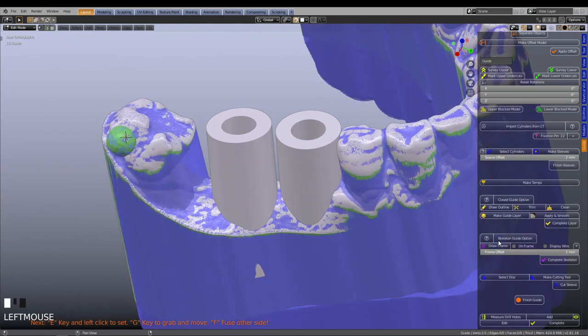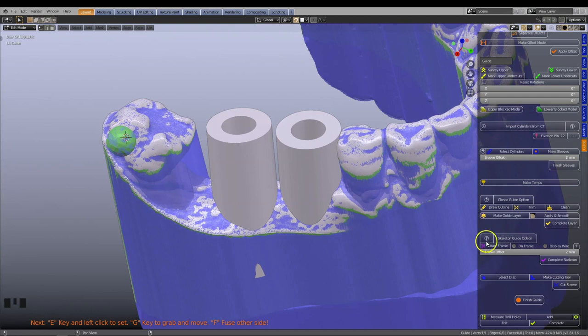Immediately the blocked out model will appear. To recall, this model is comprised of an offset model with all its undercuts removed. This is a crucial component, since this model is used to create the inner fitting surface of the skeleton guide.